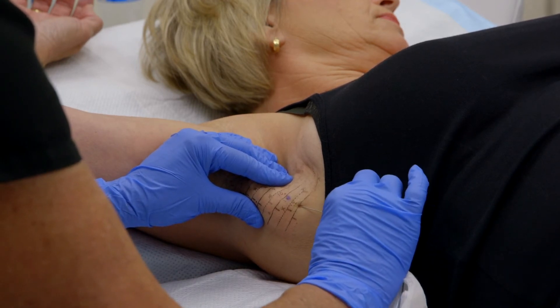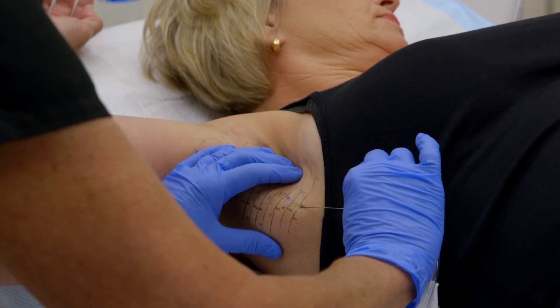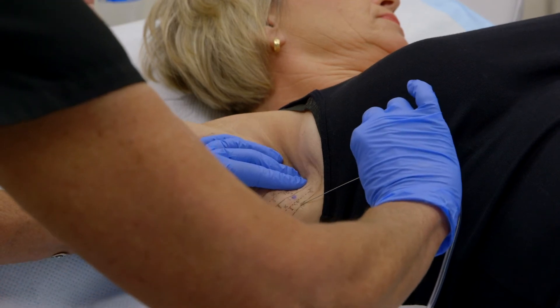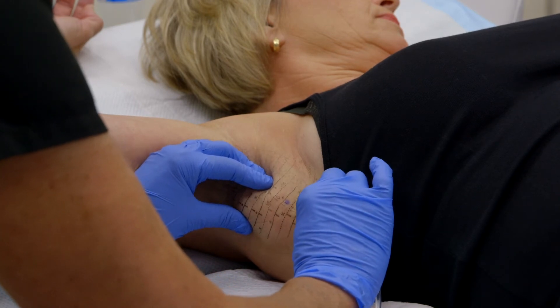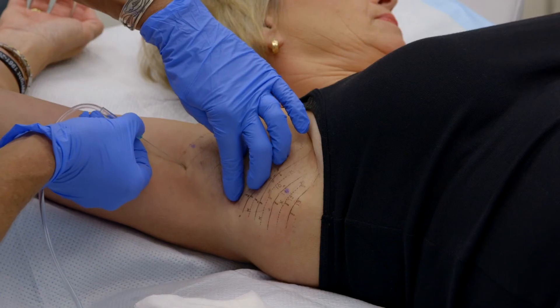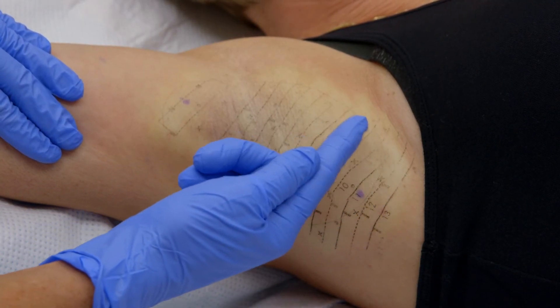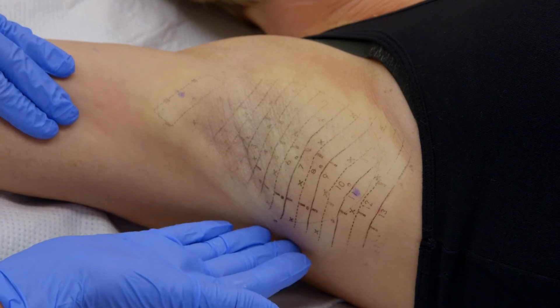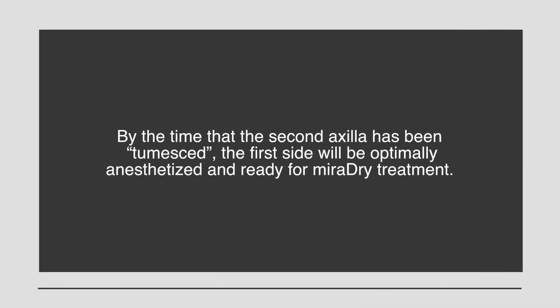In order to avoid inadvertently inserting the spinal needle too deeply, the tip of the spinal needle should always be maintained between the fingers and thumb of the non-dominant hand as it grasps the axillary skin. About 100 to 120 milliliters of TLA solution is infiltrated into each axilla. Notice the blanching of the skin following adequate tumescent infiltration. If there is an area that is not completely blanched, this might indicate an area of inadequate local anesthesia. By the time the second axilla has been tumesced, the first side will be optimally anesthetized and ready for Miradry treatment.